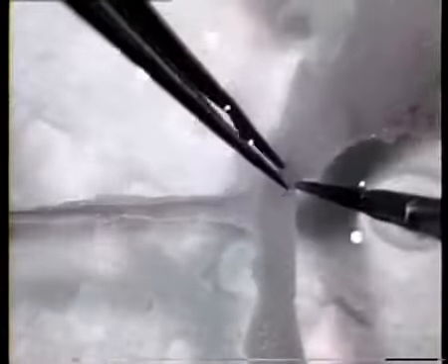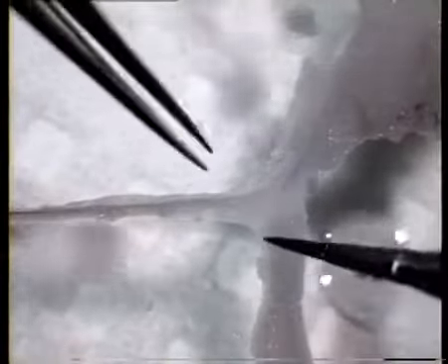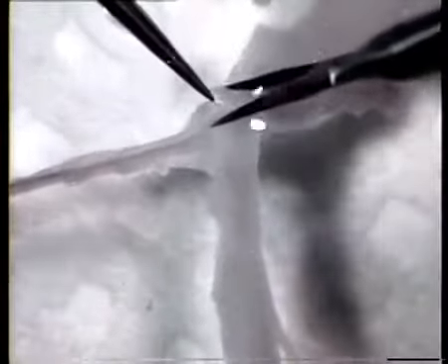The branching is being investigated here to try and distinguish between vein and artery. In this instance, the vein is lying uppermost. You can determine which vessel is which from the thickness of the vessel walls and the size of the lumen. The wall of an artery is thicker and firmer than a vein due to more muscle mass. If you gently touch the vessel walls, you can feel the difference. The lumen of the vein is often larger than in the artery.